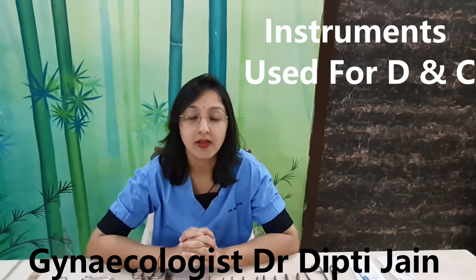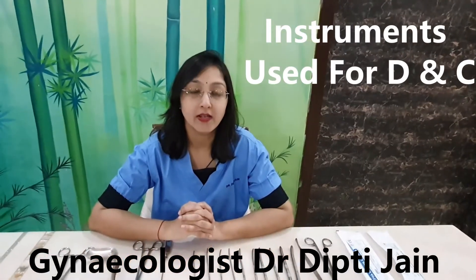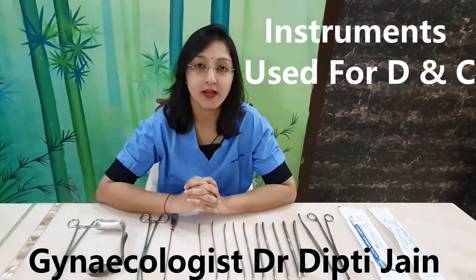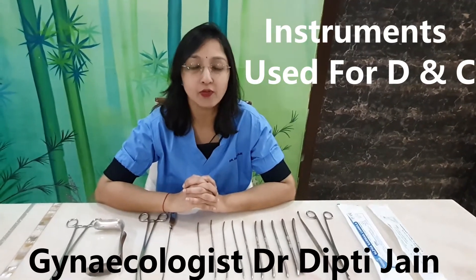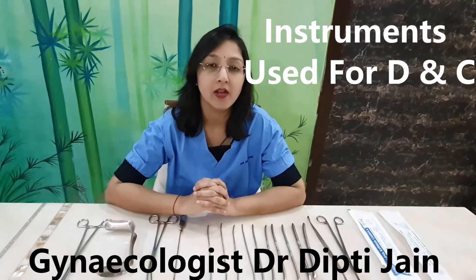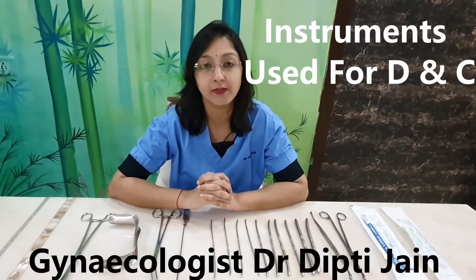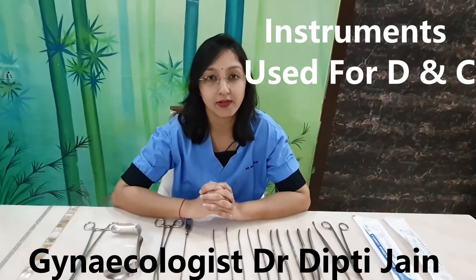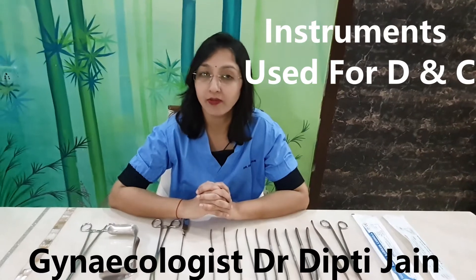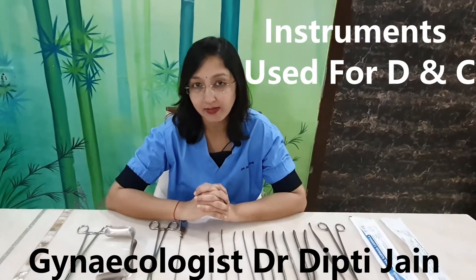I'm Dr. Deepti Jain, Gynecologist. Today we will be discussing the various instruments used in the procedure DNC. DNC is a very commonly done procedure in gynecology and obstetrics. DNC stands for dilatation and curettage. In gynecology it is used to diagnose the causes of abnormal uterine bleeding — we take an endometrial biopsy by this procedure. In obstetrics, it is mainly done to convert an incomplete abortion into a complete one or for termination of pregnancy.